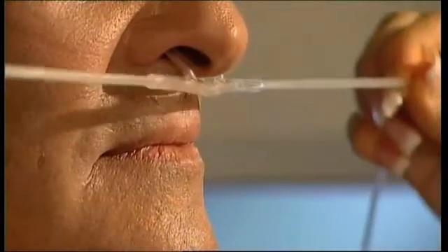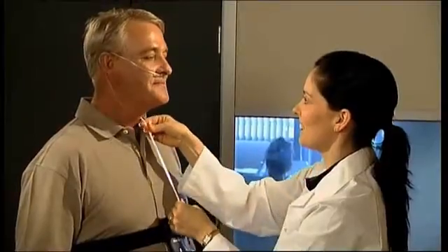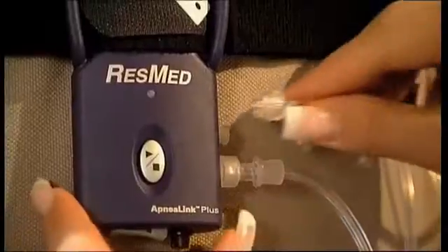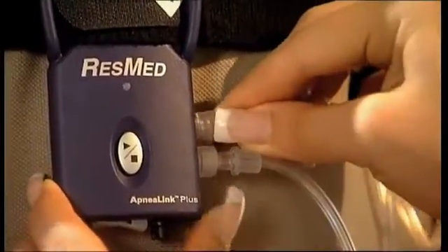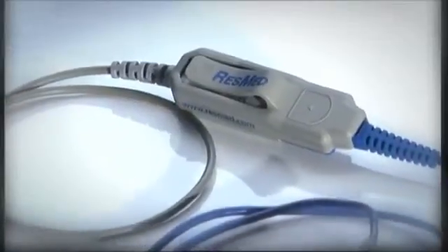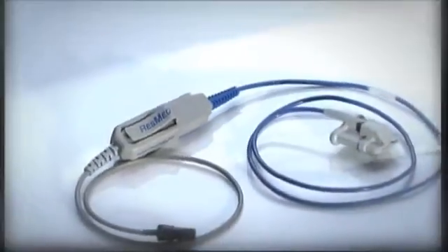The nasal cannula should be placed with the two prongs curving downwards. Loop the tubes over each ear and secure the toggle under the chin. Apply soft tape to the cheek area to hold the cannula more securely in place. Insert the end of the tube into the recorder by turning it clockwise.